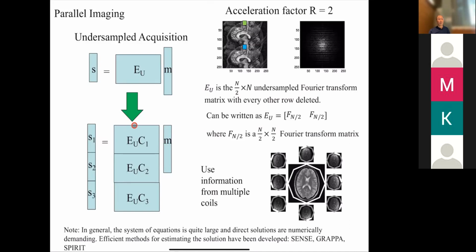So it turns out some really smart graduate students in the late 90s figured out how to do it better. Okay. So what we're going to spend most of our time on is going over what's called SENSE recon, which was invented. I think the story behind this goes, they had seen some results at the annual conference and were thinking, well, there must be a better way to do that. So I think they were on a boat somewhere, rowing on a lake, and they figured it out on the lake. And this is very common in science, where the answer actually never comes to you while you're grinding away in the lab.